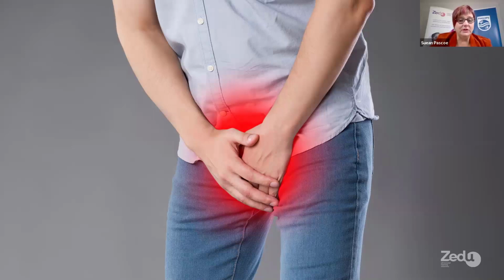Mostly this is a clinical decision, but every now and then you might need to check and use other tools to help you differentiate, is it torsion or is it epididymitis? And the challenge with that is that both of those presentations present with similar signs. So scrotal pain, swelling, redness or tenderness, and there's other things that are in common in the clinical presentation.